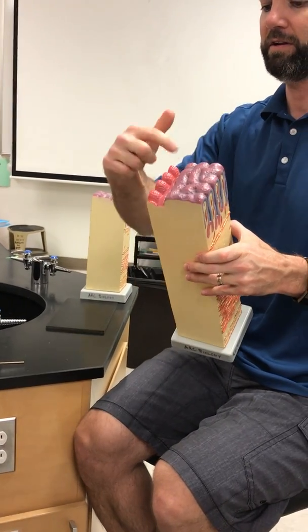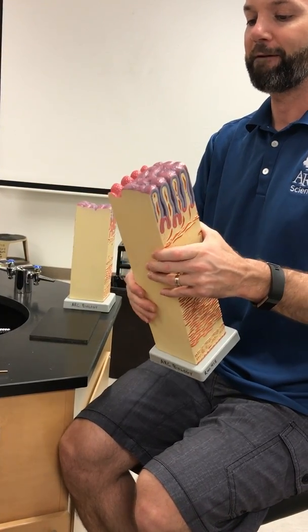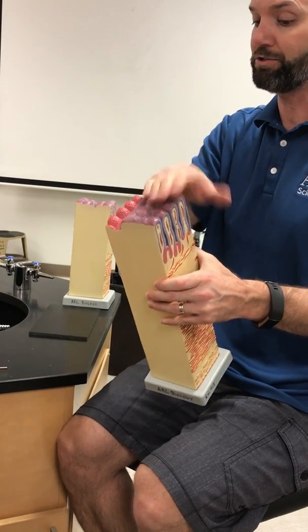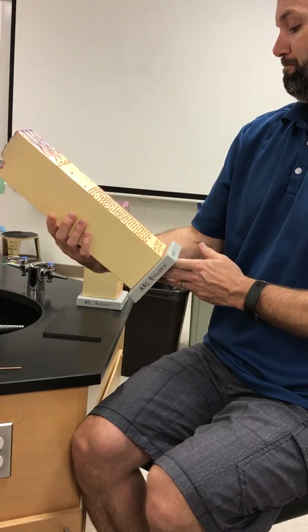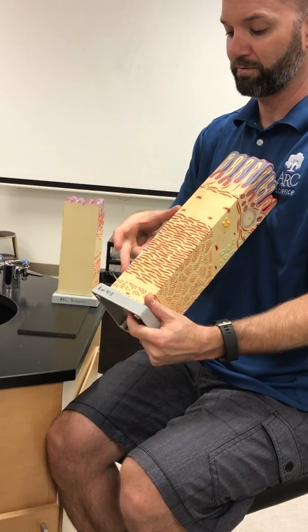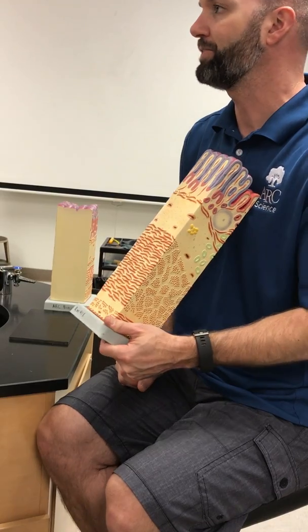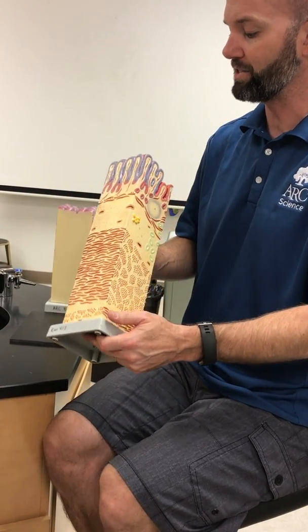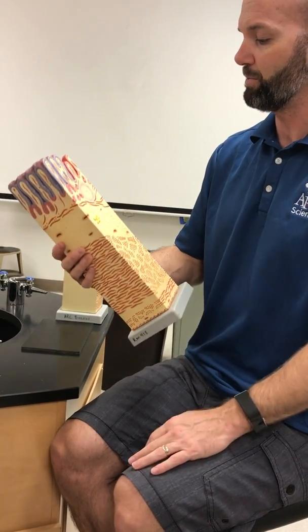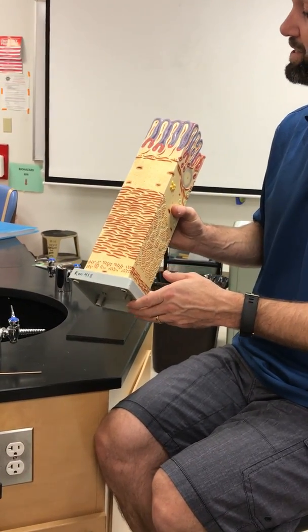So flat, and then villi. So where do you have the junction between the two? Either between stomach and small intestine, or small intestine and large. This is a giveaway here. Where do you have a crazy thick layer of circular smooth muscle? That's your sphincters. One of the biggest sphincters is the pyloric sphincter. So this is definitely the junction between stomach and the small intestine. We just don't have those three layers of muscle at the junction, but it is stomach.